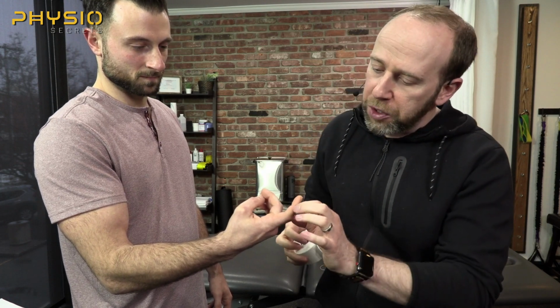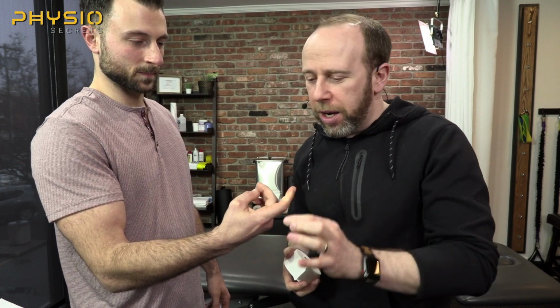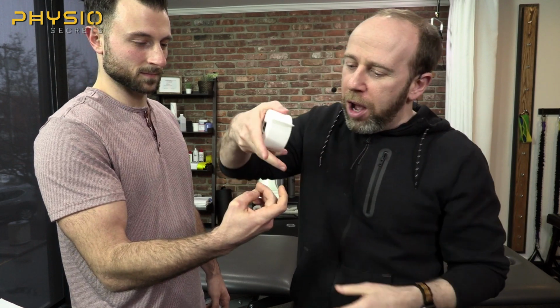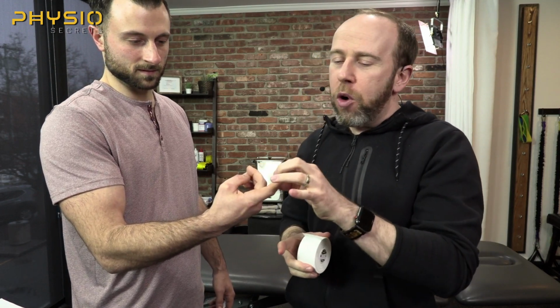Let's just say. So what I want to do is keep the joints above and below his finger as free as possible. And I want to apply the tape such that I'm going to anchor just above the joint I'm trying to block and just below the joint I'm trying to block. I'm trying to make a mechanical change, not neurological, not chemical. So I'm going to pre-position his finger in the position I want to keep it, apply the tape on the correct axis, which means on the anterior palmar side of his hand, not the dorsal side, so that when he goes into finger extension, the tape goes on stretch before his finger flexor does, or before his finger tendons do, so that I protect the stuff on this side of his finger joint.